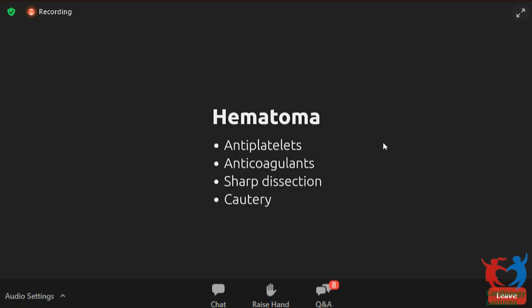There's a good question on instilling local antibiotics. The idea is that you instill an antibiotic, which does not usually get absorbed, in the pocket. This is done at most centers. We instill gentamicin, but the evidence for this is not very strong. Proper trials have not been done, and most of the expert consensus is that it may or may not be useful. Nobody really knows how useful it is.